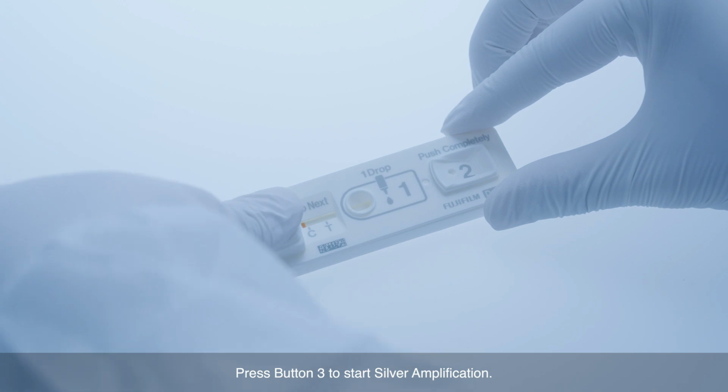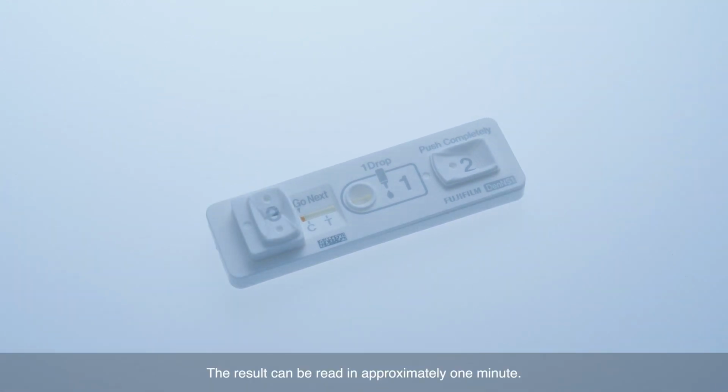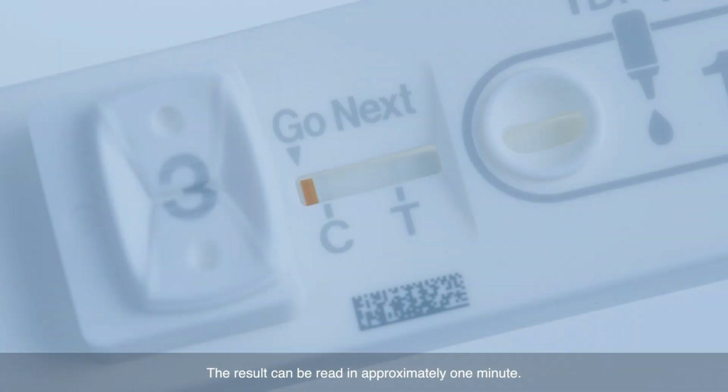Step 3. Press button 3 to start silver amplification. The result can be read in approximately 1 minute.